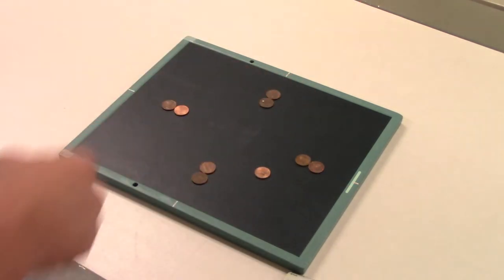Let's make that exposure. You guys hang out in here. This is a camera, so it's really immune to x-ray, so you get to be in the room while the exposure is being made.